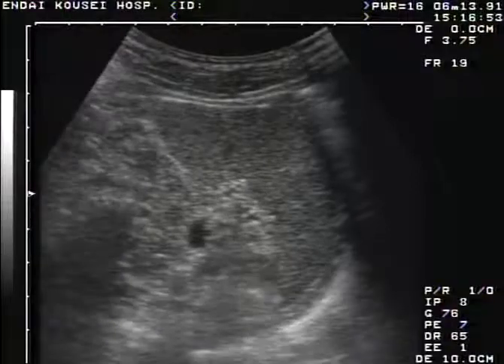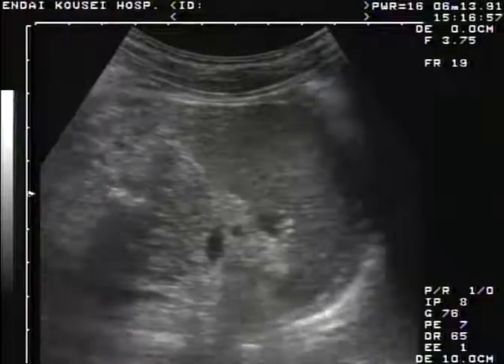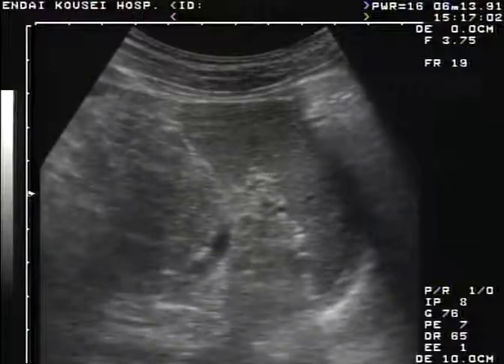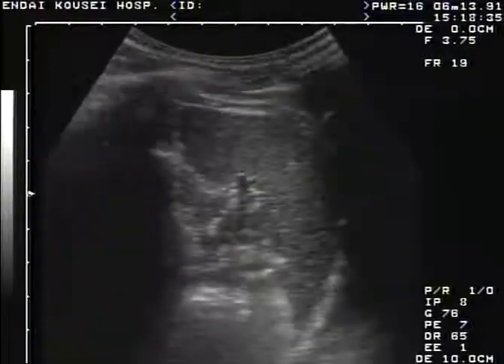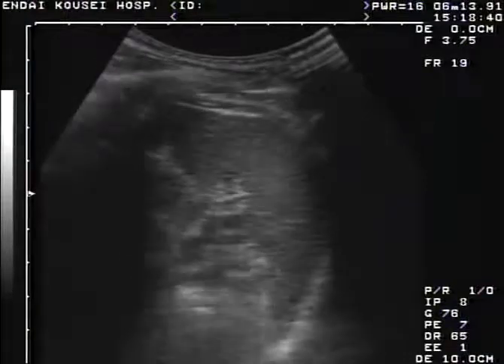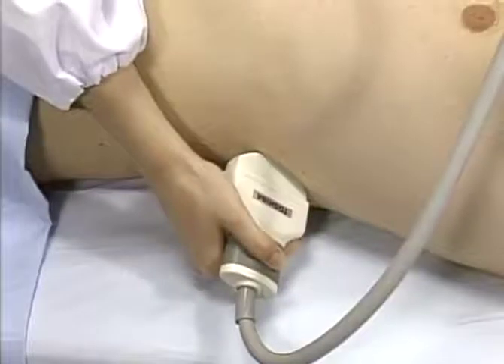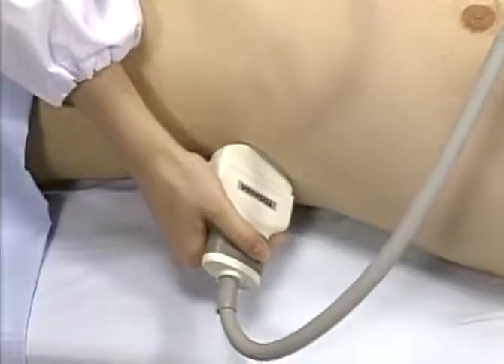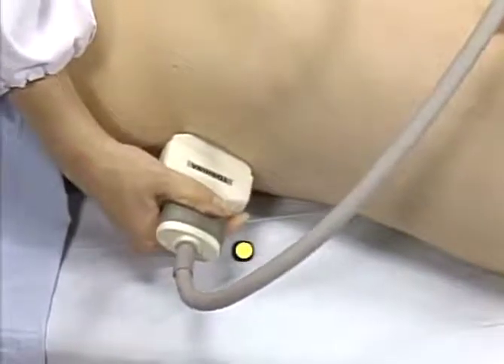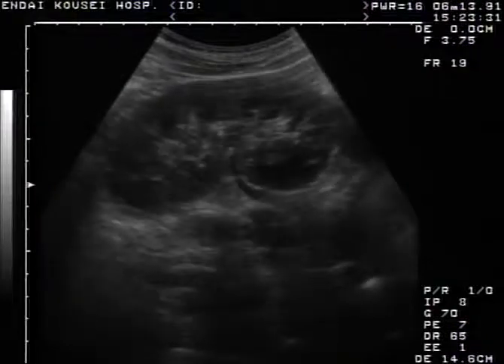The spleen closely reflects the condition of the liver. A splenic abnormality suggests hepatic disease. This finding is helpful in evaluating the liver later. At times, a swollen lymph node can be detected in the periphery of the hilum of the spleen. As you see, the spleen looks the largest in this plane. How about the plane located one rib beneath, towards the toes? The left kidney comes into view.